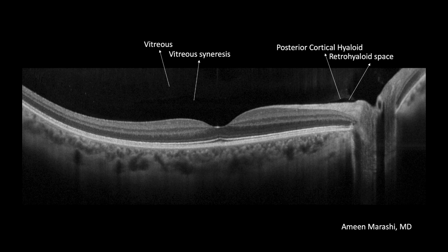That's why, along with the retinal fiber layer, they are analyzed as the ganglion cell complex in topographical scanning of the optic disc. The retinal fiber layer appears as a hyperreflective layer that is thicker on the nasal side than the temporal side of the macular scan, which can help to identify the nasal and temporal side of the macula. Hence, it will help to determine the right from the left eye. This layer is essential for circle and topographical optic disc scans when evaluating glaucoma.